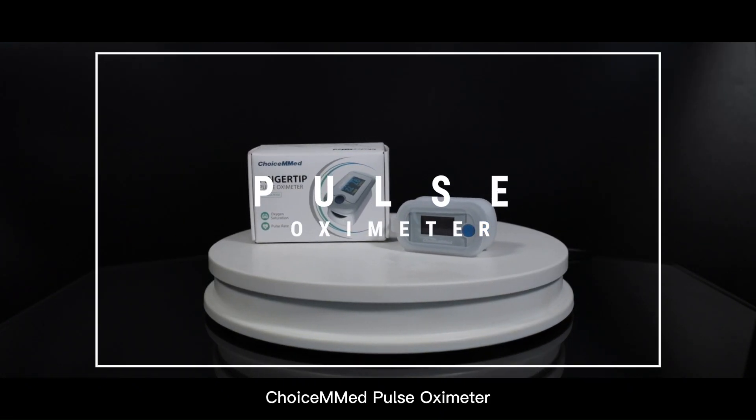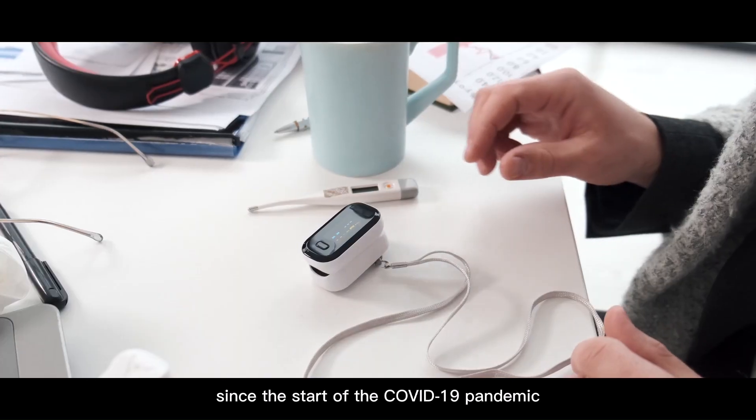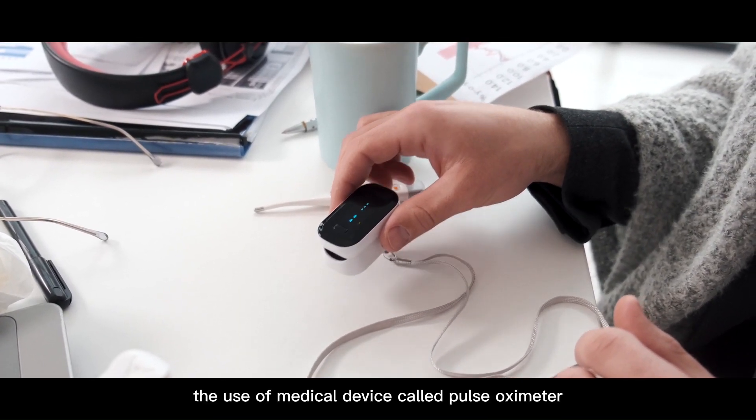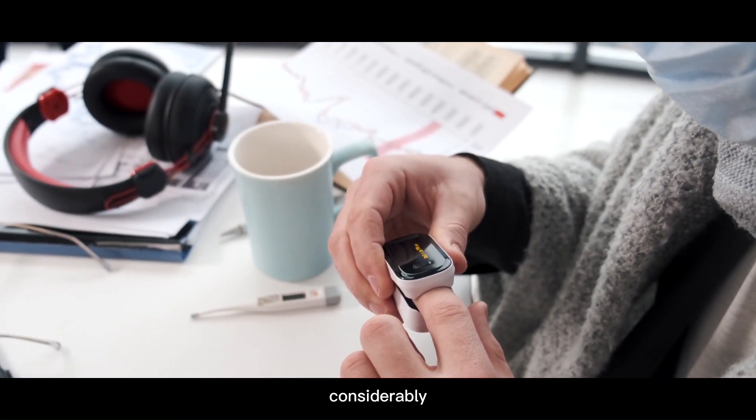ChoiceMed Pulse Oximeter. Since the start of the COVID-19 pandemic, the use of a medical device called a Pulse Oximeter, which measures blood oxygen levels, has increased considerably.